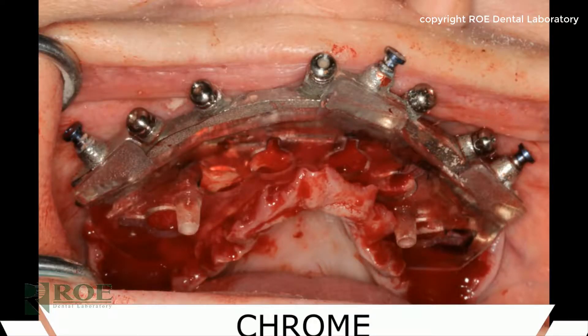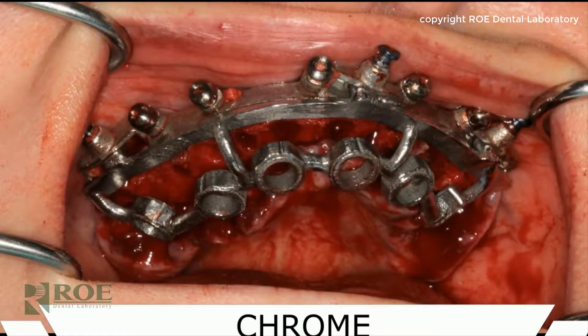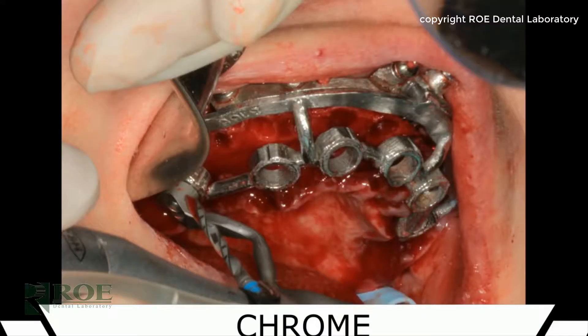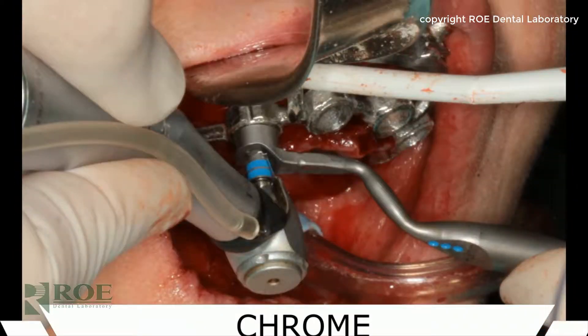Once it fits and seats passively with no rock, you can proceed. In fact, some doctors try in the prosthetic at this point just to make sure the bite is right so there are no surprises at the end. Now it is time to start drilling the osteotomies and placing implants. This is a Straumann BLX guided kit — their newest implant system.